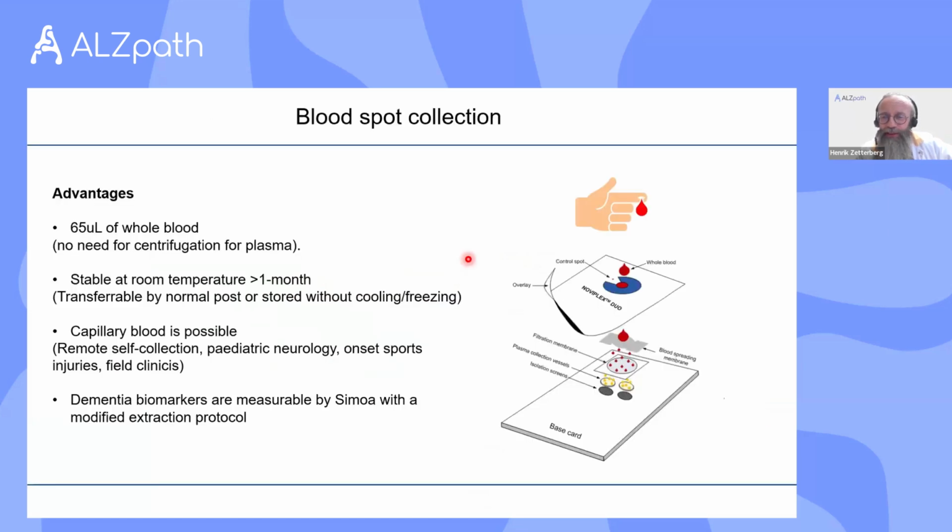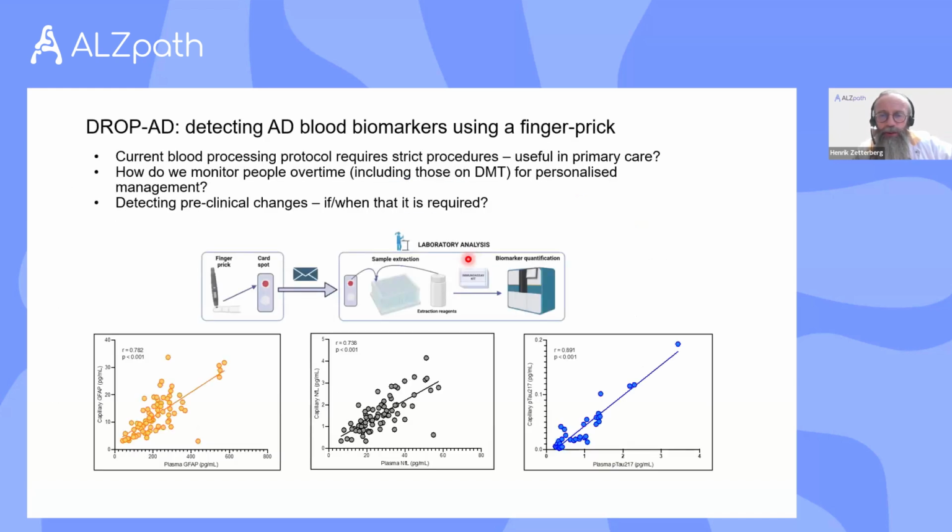One thing to make the biomarkers more available has been also to look at different ways of collecting this plasma. One could say that the regular venous puncture and collection of EDTA plasma is one way forward, but now it also looks like finger prick testing will work. And I think Kaj will talk more about this. This is what it looks like for pTau217 if one looks at finger prick test and collection of a dried plasma spot compared with regular plasma pTau217: nice correlation. The absolute concentration is different, but the correlation is there.